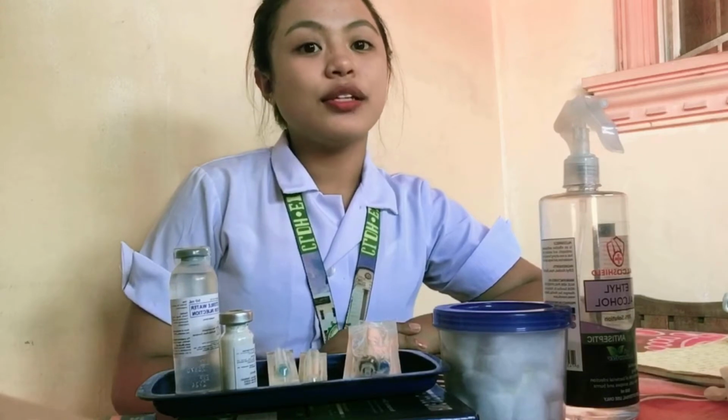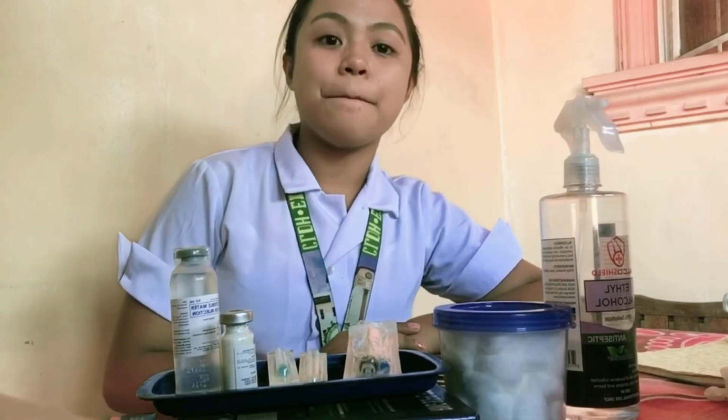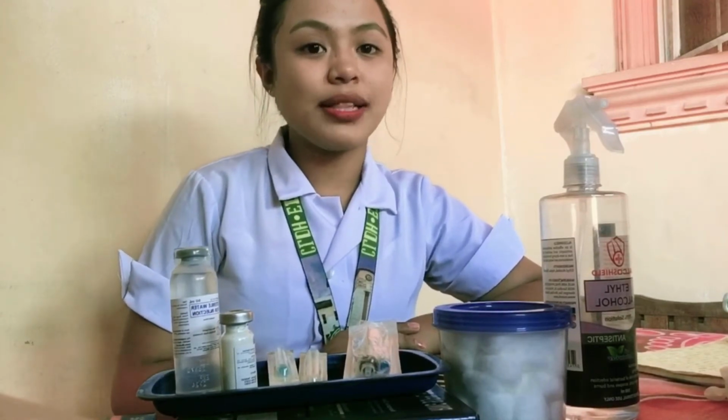Before we start the procedure, we need to check our MAR, or the medication administration record, or the doctor's order. We need to check the label of the medication against our MAR to ensure that we are preparing the right medication for our patient. After I ensure that, I need to perform hand hygiene. The rationale is to avoid the spreading of microorganisms or cross-contamination among clients.